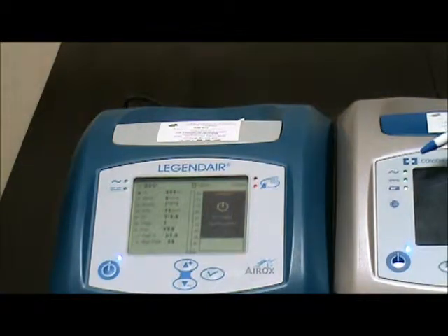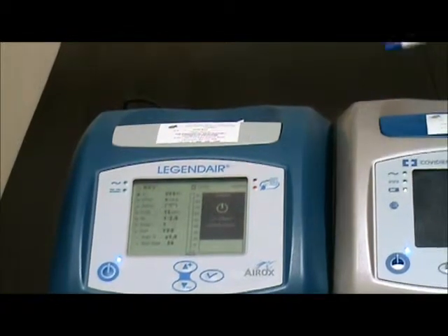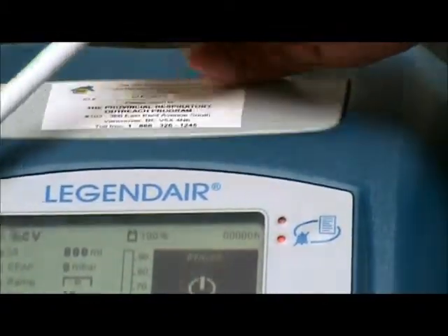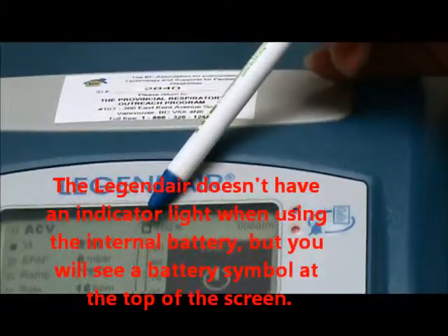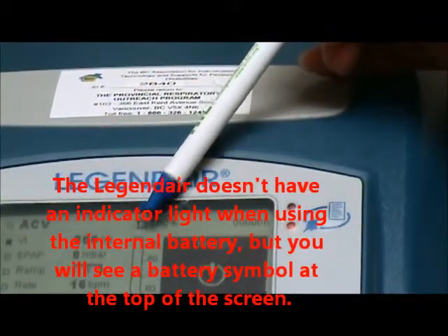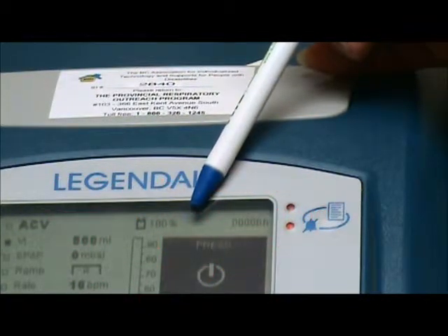On the PB560, there's a light here showing that the machine is working on internal battery right now. But on the Legendary, you don't have that indicator light. What you have on the Legendary is the battery symbol on top of the display. Right now it's showing 100%, which means the Legendary is working on internal battery.